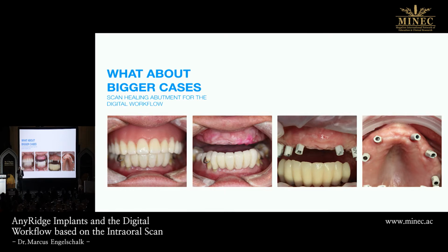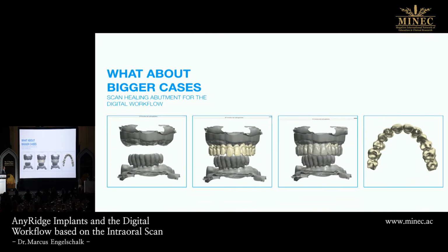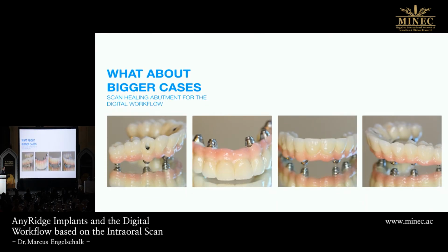And if you read some articles about the precision of scan bodies or intraoral scanners, they always measure three points, distance of three points in one jaw. This is the most important thing to read if you are deciding to choose an intraoral scanner for you. So if we scan this, the scan will be like this, and the technician now can do with his CAD/CAM software everything we want to create perfect teeth. And at the end, it's like this.